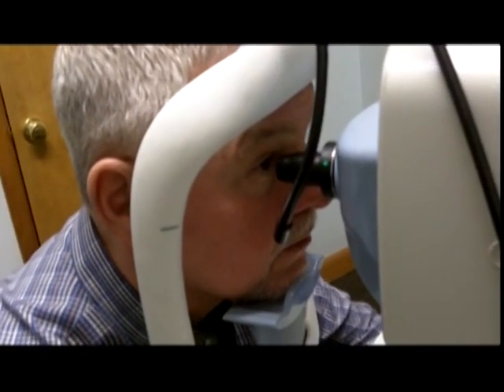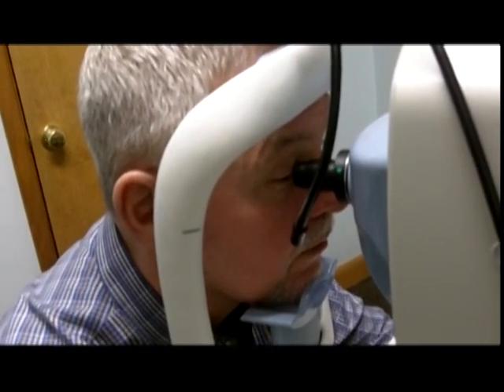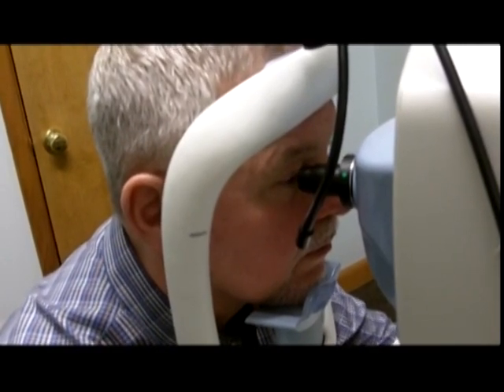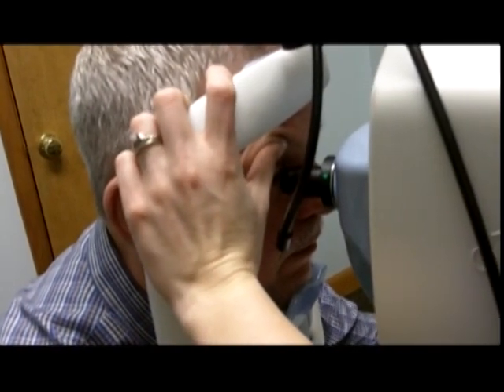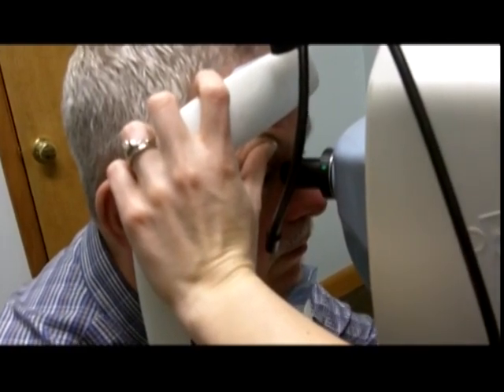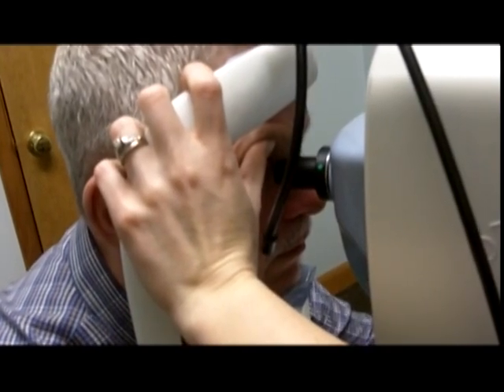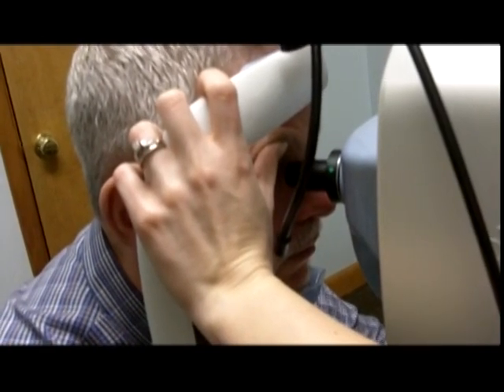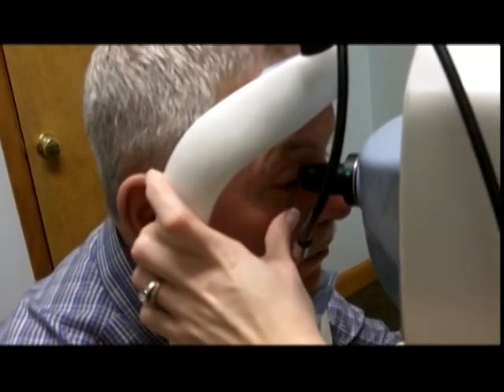The biggest problem is when you have the patient look down so we can evaluate the top of the lens. Go ahead and look down for me — we're doing the vertical scan of the top of the lens. It's important here to grab the eyelid and lift it up so the whole lens is visible on the scan and we're not getting the eyelid in the way. His eyelid is out of the way and I can see the sclera and the lens.